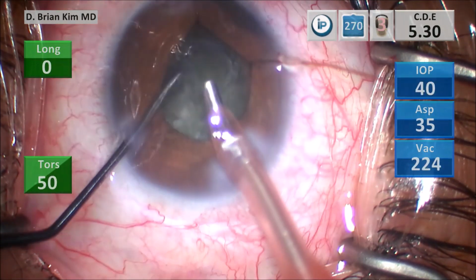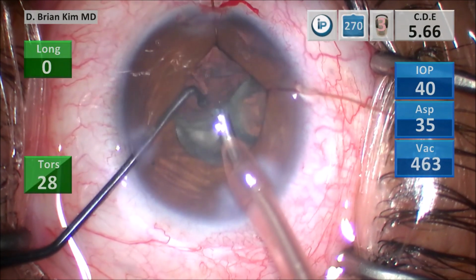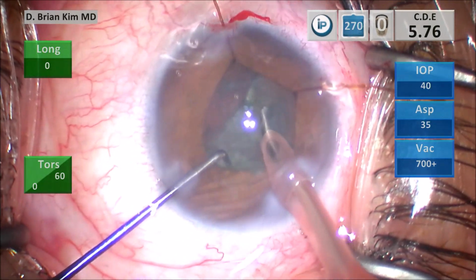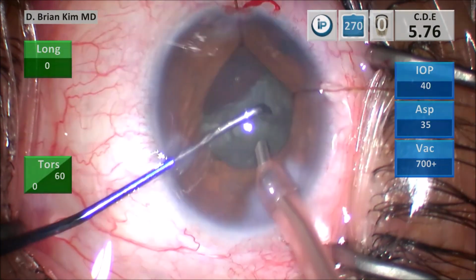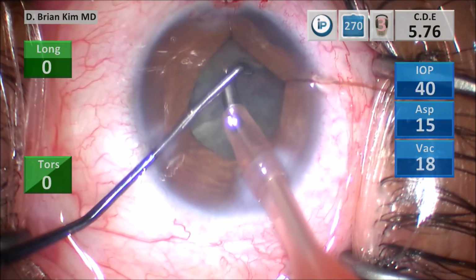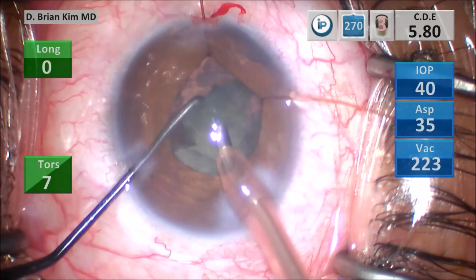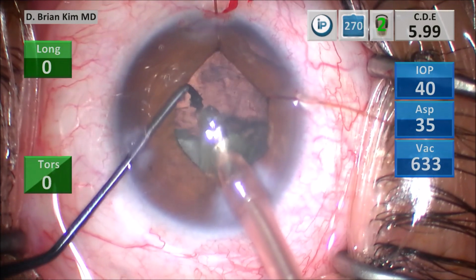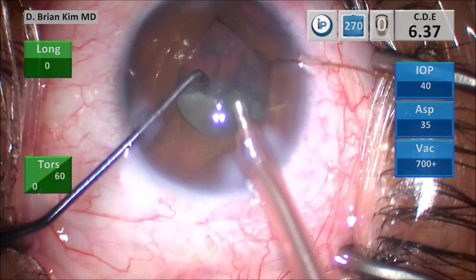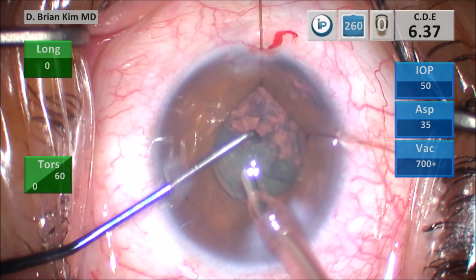As you can see, I'm just doing very gentle lens removal, performing multiple chops, primarily depending upon vacuum to crush and disassemble that second quadrant. I tried to make some adjustments to my setting.